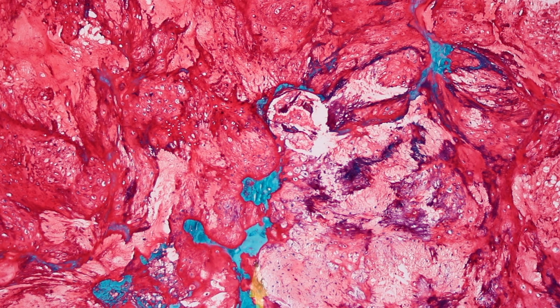So what do I do in a curettage specimen where I see maybe one single focus of what looks like infiltration? I want to see a significant amount of infiltration because I don't want to overcall a tumor a chondrosarcoma by virtue of a problem created by plane of section.